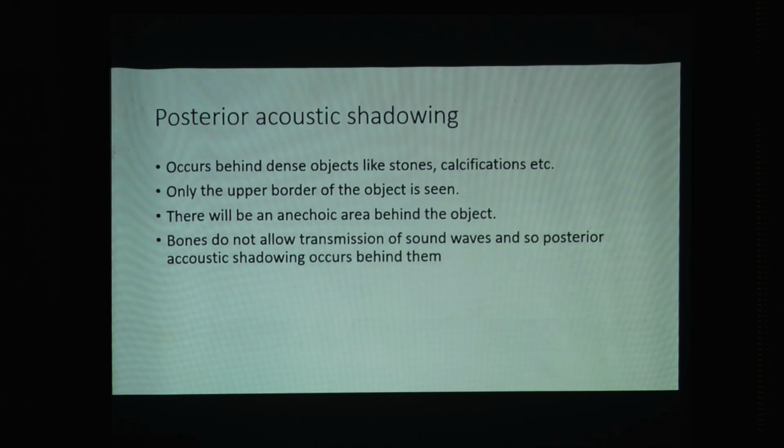Usually it is seen behind the stones, calcification, bones, ribs, etc. Only the upper border of the object is seen. There will be an anechoic area behind the object, because bones do not transmit the ultrasound waves, so the posterior shadowing occurs.